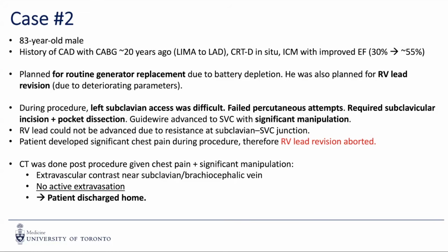After the procedure, given the manipulation and chest pain, they had a CT scan that was done. It did show a small hematoma. However, there wasn't any active extravasation, and therefore the patient was discharged home.